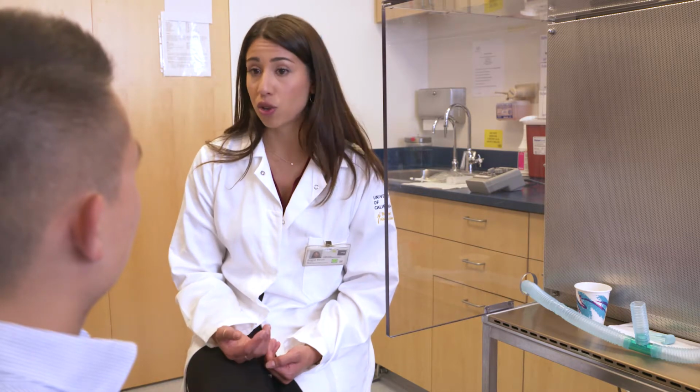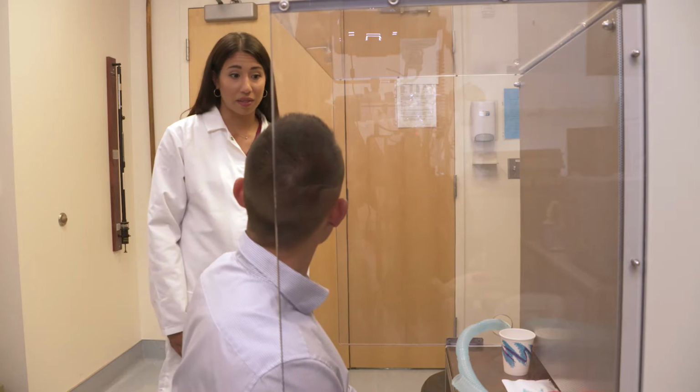So, in summary, this is a 12-minute test meant to collect a sample of phlegm or sputum from deep in your airways. Every 2 minutes, I will stop you, ask you to come off of the mouthpiece and spit into the cup. You'll then return to the mouthpiece, take 2 deep breaths, and then cough deeply and vigorously to try and bring up any phlegm or sputum that you can into the specimen cup. I will then monitor your breathing by having you do a peak flow. Do you have any questions? No questions. Okay, Xavier, let's get started.